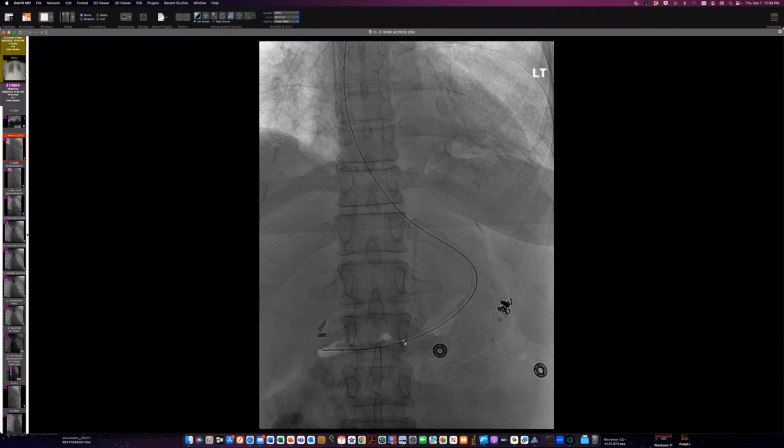Have you guys ever seen this placement before? I need to look up the history and find out why exactly they did that, but I don't have that on tap right now. So they had to pass the needle carefully through the mediastinum to get to the esophagus, I think through the lower neck. It's above the clavicle, so it's through the neck from above to get into it and down. I'll see if I can get you a better description of this. No, I haven't seen that.